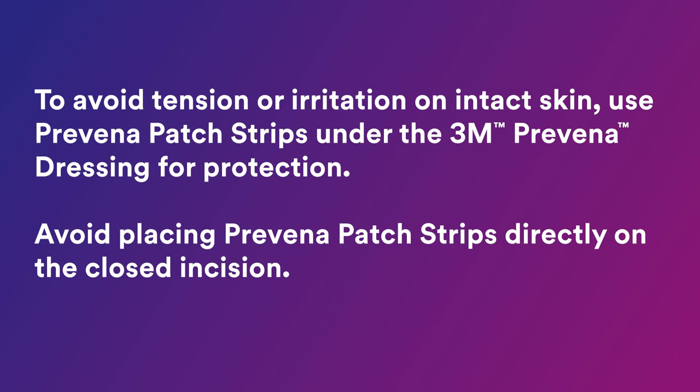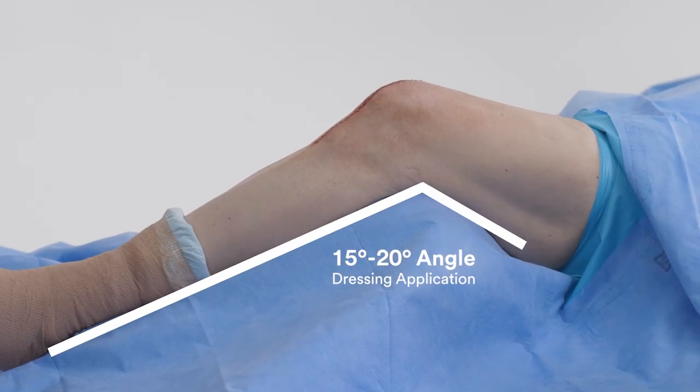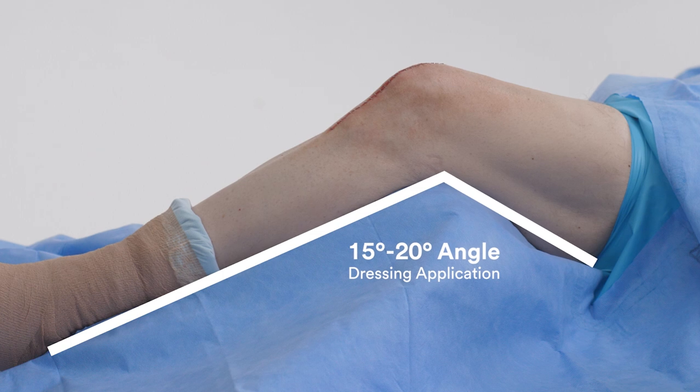To avoid tension or irritation on intact skin, use Praveena patch strips under the 3M Praveena dressing for protection. Avoid placing Praveena patch strips directly on the closed incision. The knee should be positioned at a 15 to 20 degree angle for dressing application. This will aid in minimizing skin tension during wear of the dressing or therapy.